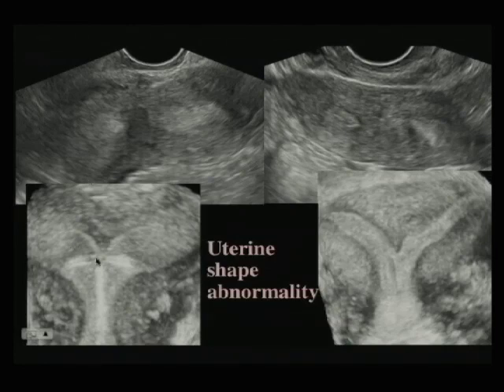This is an interesting case because you can see the IUD is in fact in the uterus, but it's low in the uterus because it was not able to be pushed up due to this septum. So this patient can easily get pregnant up here in the parts of the uterus which are at the fundus, which you can see clearly in 2D do not contain an IUD. And here is a similar uterus showing that broad subseptum that divides the uterine cavity in two.